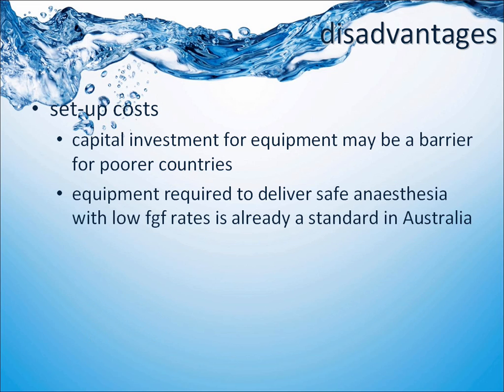With advantages, there always come the disadvantages. Initially, the setup costs may prevent poorer countries from starting this technique. Fortunately, that's already a standard in most of the developed countries, including ours.